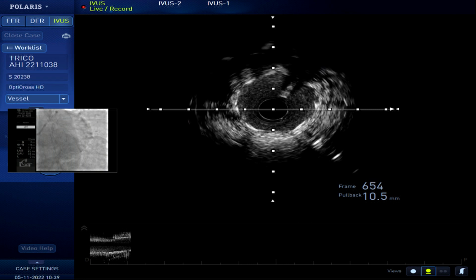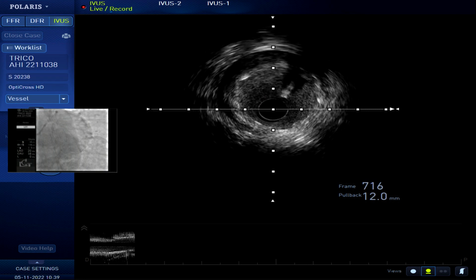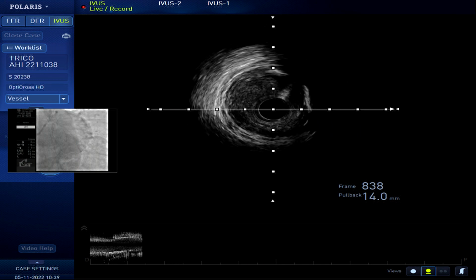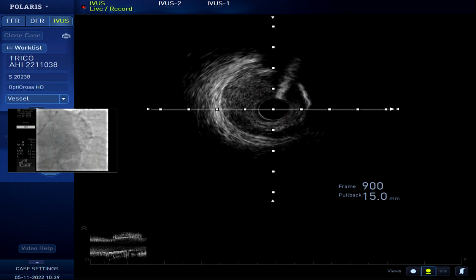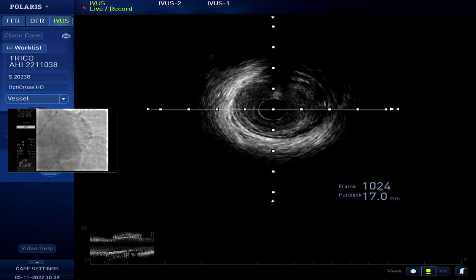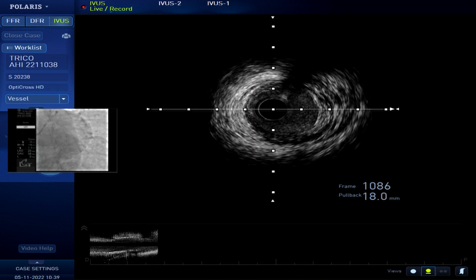It is the stented portion in the LCX, right? OM, coming to aneurysm. Okay, this is aneurysm. I think it's perfect. No? Yeah, not necessary. Stop.